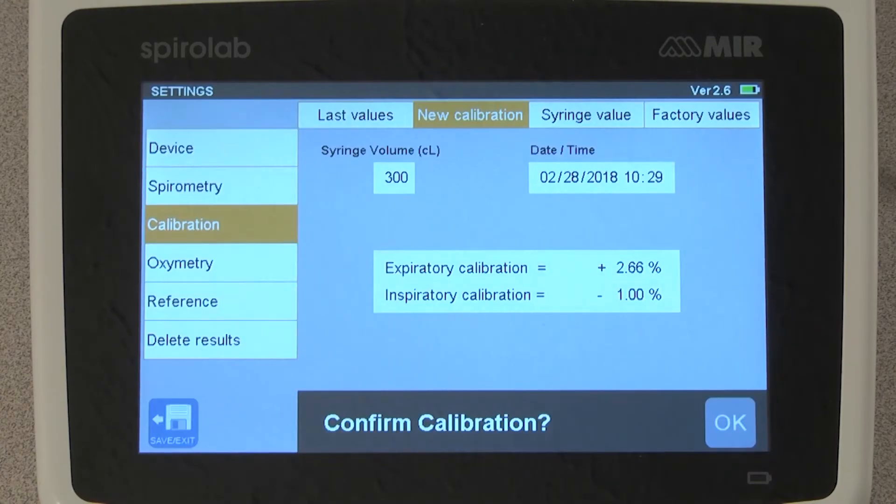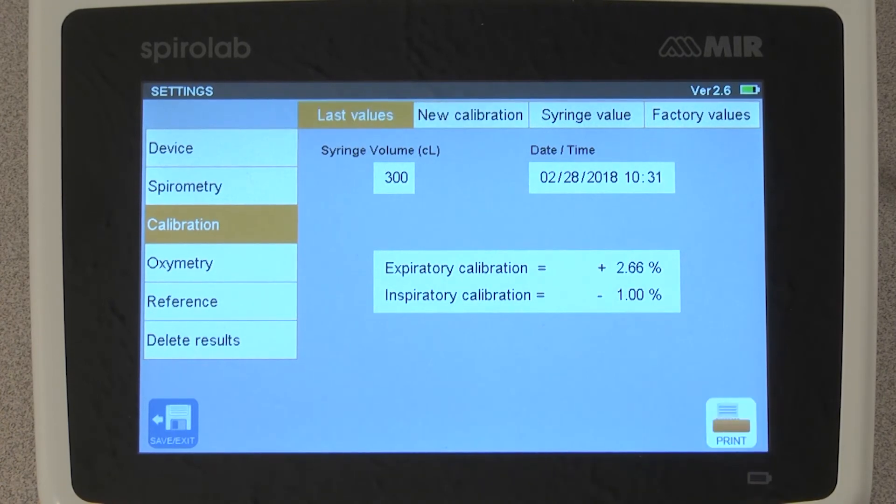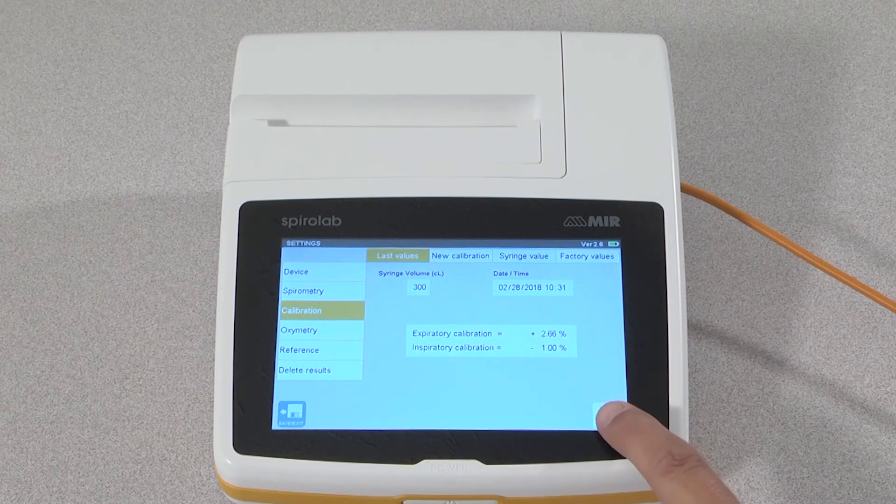At the completion of the slow speed, stop and the device will automatically calculate the results and show you the expiratory and inspiratory calibration check numbers. We are looking for the calibration check to be within plus or minus 3%. If this is within the range, tap OK and the calibration test is done. You can print out the calibration check report by tapping the print icon in the lower right corner and insert the results into your file.